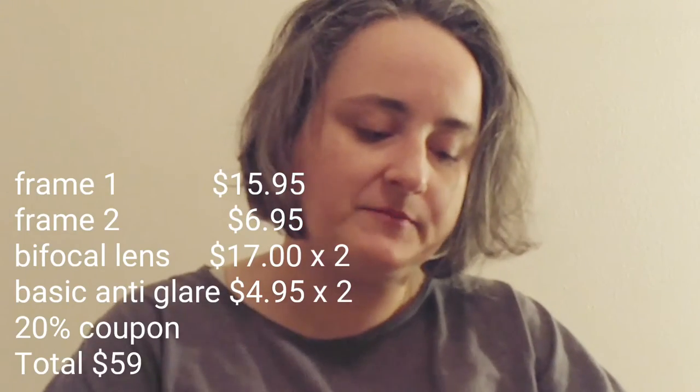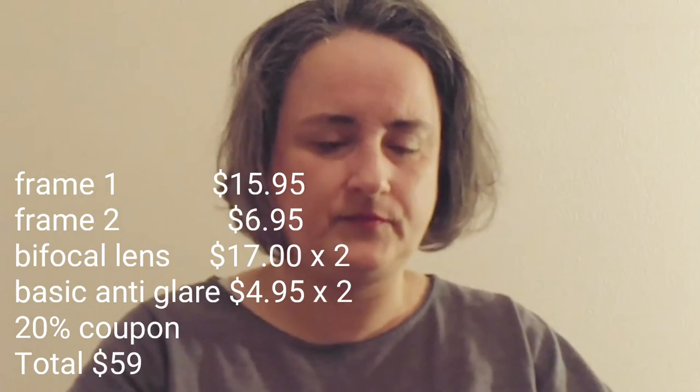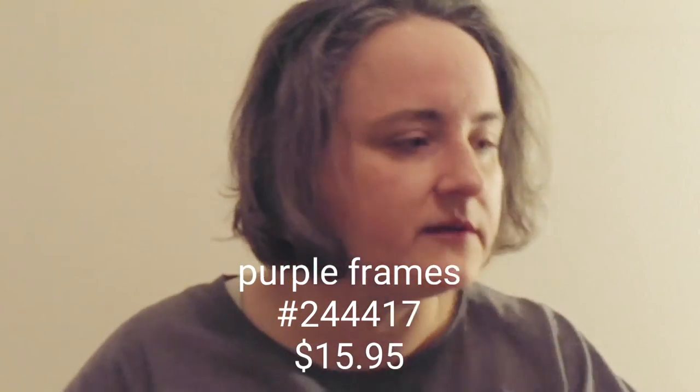Usually the number is on the frame - I don't see it. This pair of glasses I'm fixing to show you right now is frame number 126215. This pair of frames with the bifocals - the pair of frames was $6.95, and then the bifocal lenses... well, the whole order was $54. The number isn't on the other package; I don't know why. I'll look it up and insert it.